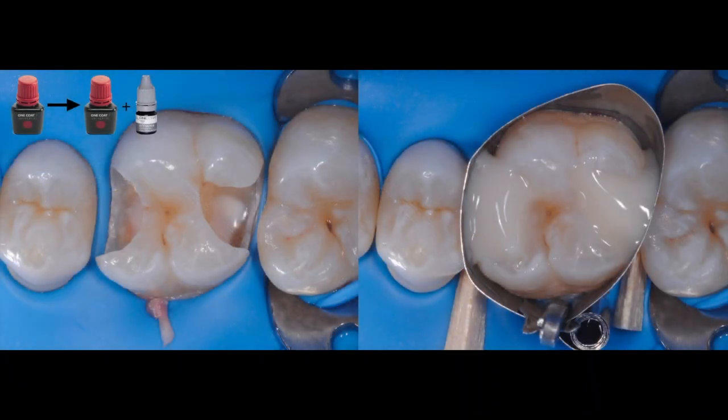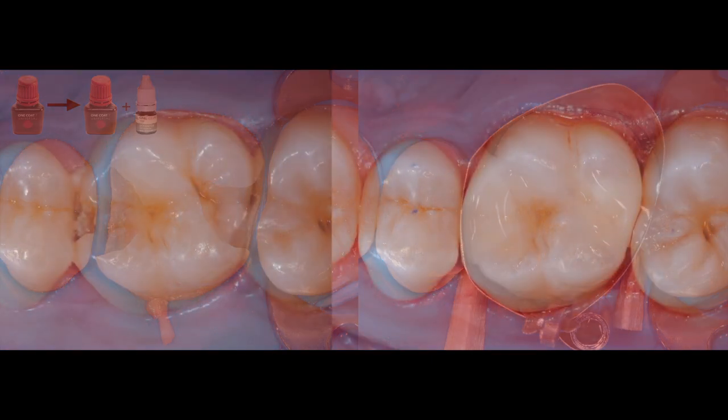Once hybridization is completed, we simply fill up and cure. Here is a side-by-side photo of the before and after. Look at the chameleon effect properties of the universal shade as well as the smooth surface we were able to achieve after occlusal adjustment using the ShapeGuard system.